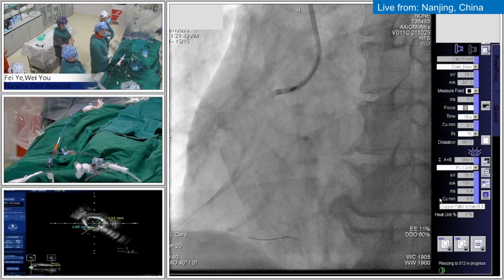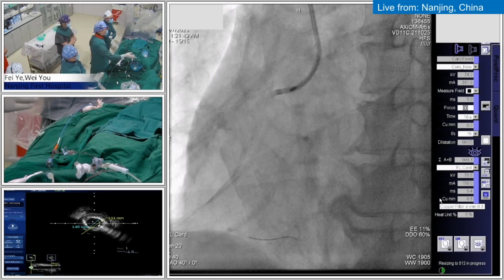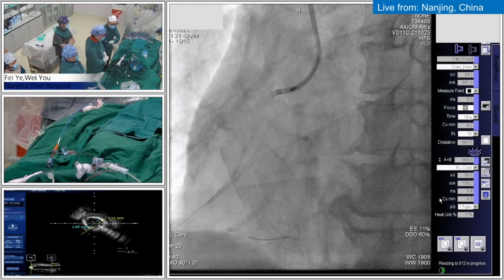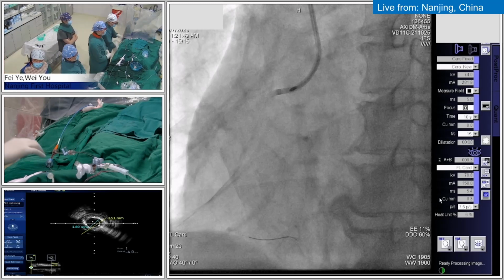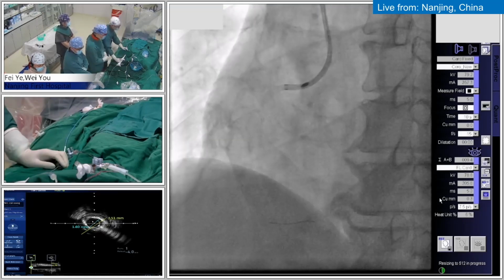Chief, for the final round I just want to use the low speed to polish. Okay. No problem. 待会要降点速度啊，抛光。150,000. Okay. So till now the patient's hemodynamics are stable. You ready? Okay, yeah. I'm ready. Okay, maybe the final round.